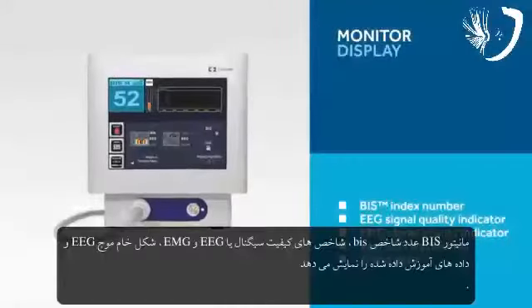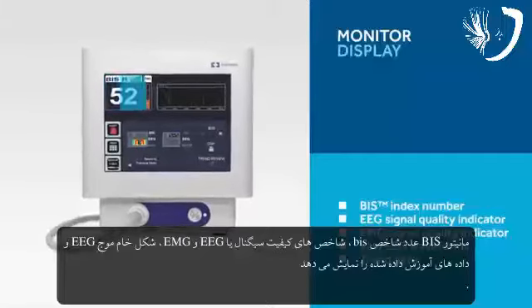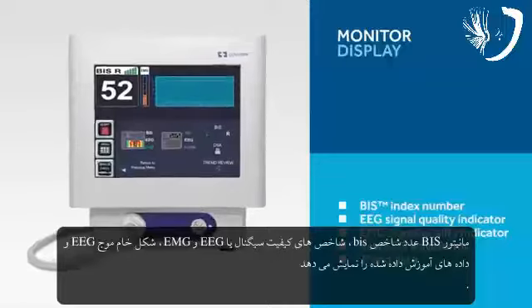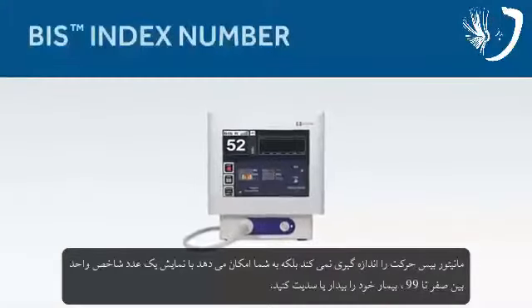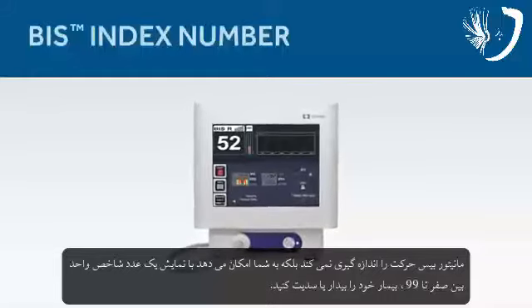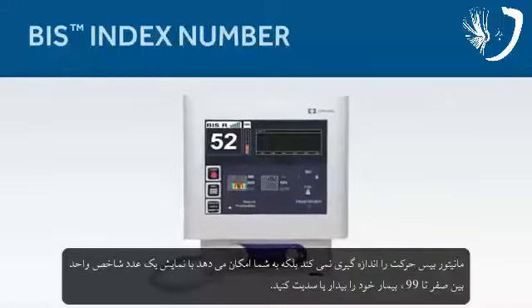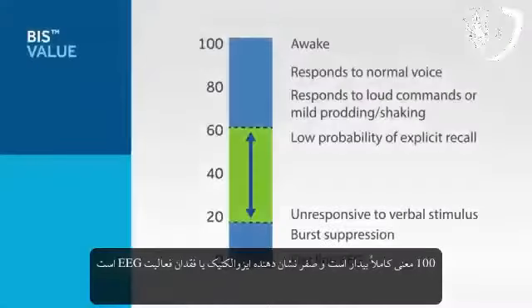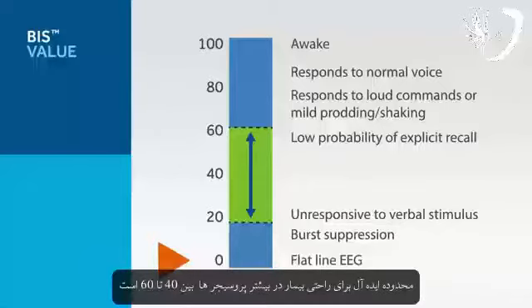The BIS monitor displays the BIS index number, signal quality indicators for EEG and EMG, raw EEG waveforms, and trend data. The BIS monitor does not measure movement. Rather, it lets you know how awake or sedated your patient is by displaying a single index number between 0 and 99. 100 means completely awake, while 0 represents isoelectric or no EEG activity. The ideal range for patient comfort for most procedures is between 40 and 60.